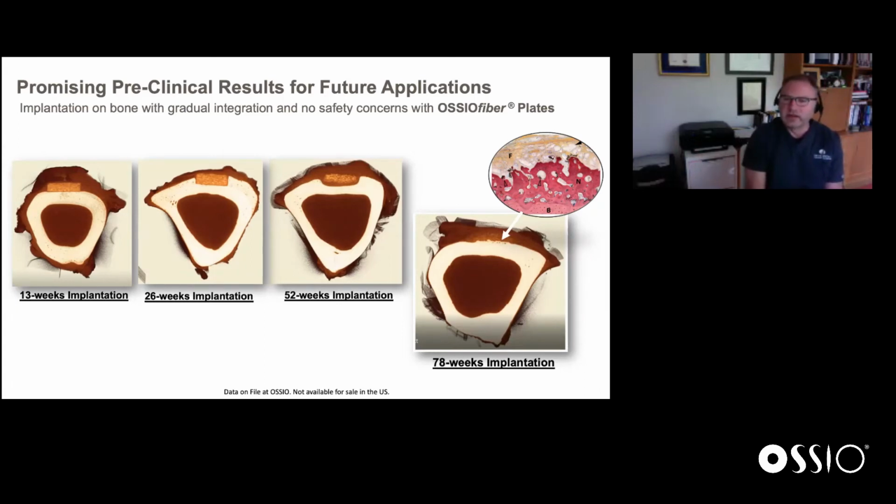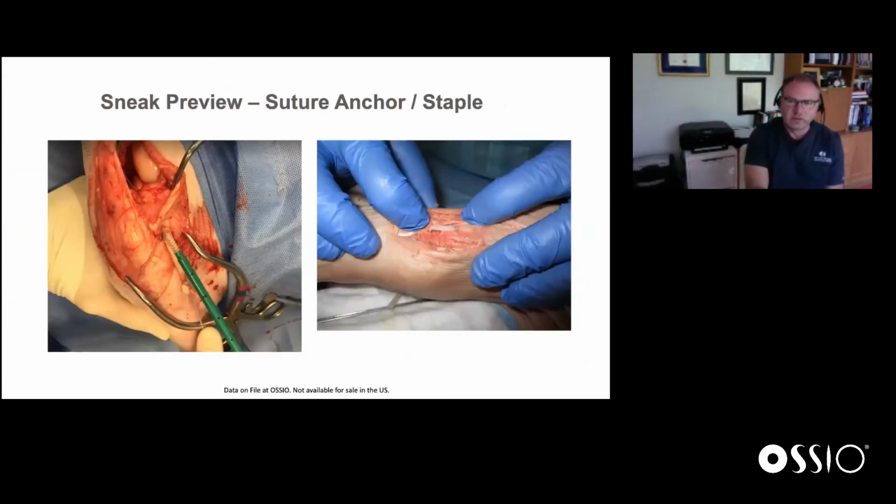And so it's just amazing to me when you see that versus our early experience with bioabsorbable implants, where if you've ever MRI'd one of those bioabsorbable screws over time, sometimes you'll just see a hole there. It just disappeared. It dissolved, but nothing else replaced it. And that's just not what you see with this material. It really is, as Luke said, a very good pairing of the biology of how, as it's replaced, it becomes bone. It's pretty amazing.